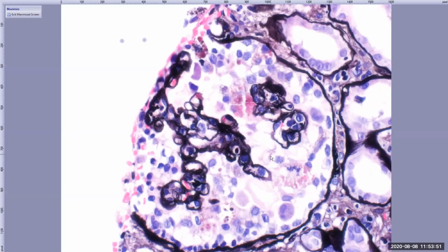And where did it go? It's all just inside there. It's like a balloon just popped, sitting inside the architecture. It's completely collapsed, and you see the proliferation of the overlying epithelial cells. And over here, you can see even a mitotic figure. So this is collapse.